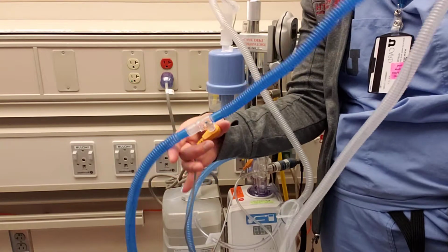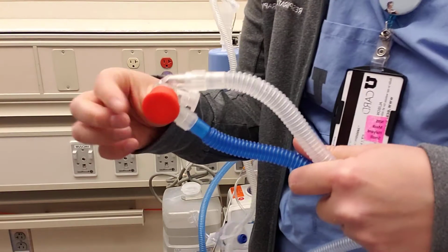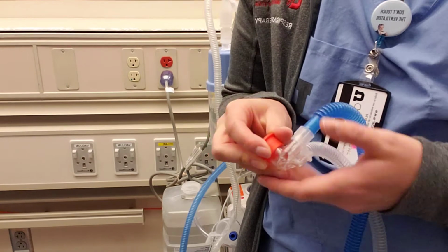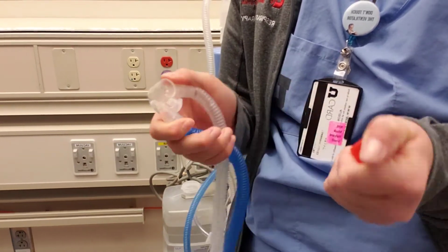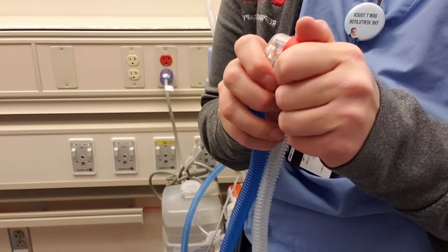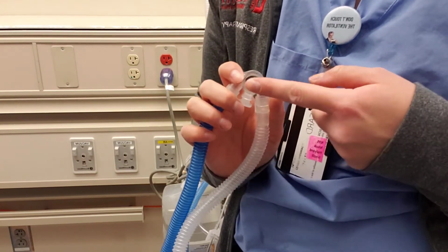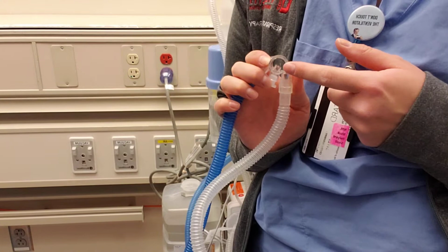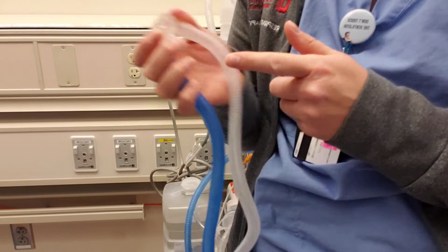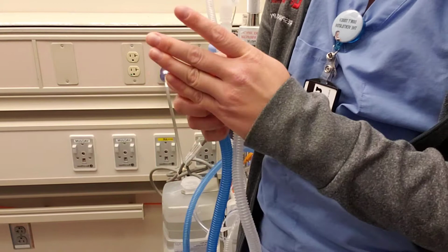Next, we have our inspiratory limb with our heater wires up to our adapter up here, our patient Y, and we will give bubble CPAP non-invasively. This is the adapter, where it will come occluded to keep it safe and also to make sure your equipment is running properly. This is where you will attach whatever interface your facility uses. I am used to the RAM cannula, so the RAM cannula can attach directly to this adapter. It's a universal adapter, so whatever the facility you're at uses, attaches here.